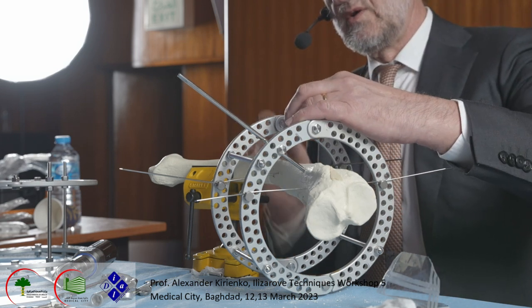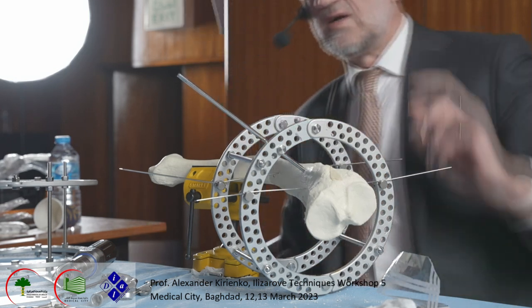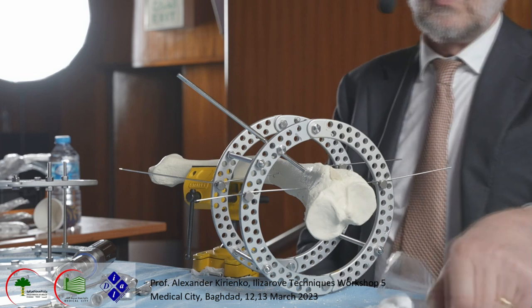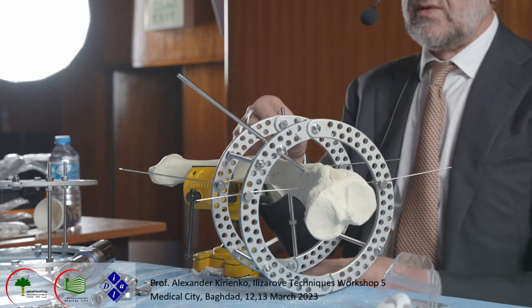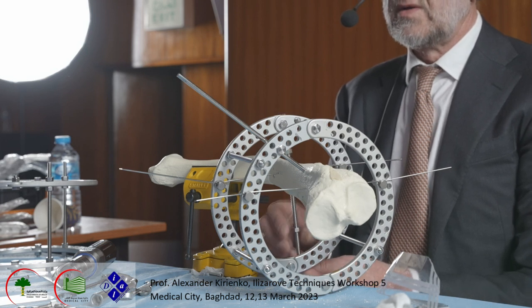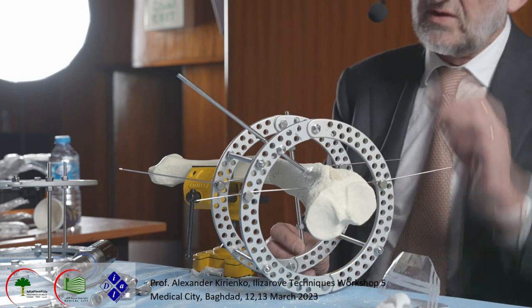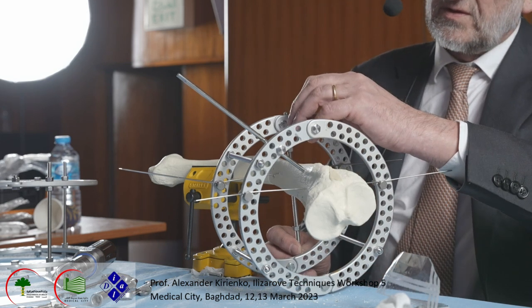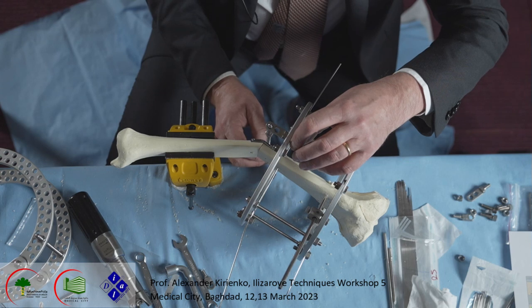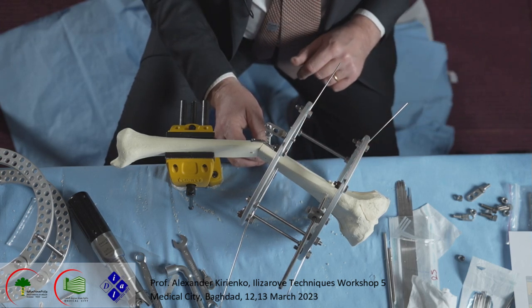And what we do here, I want to build the hinges, and I need to build them at the external border of the tibia, like this. I want to build it here, okay? Like you see here, it is exactly what I want, at the level, and it should be on the external border of the cortex.